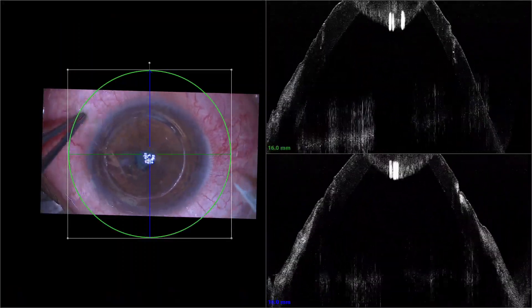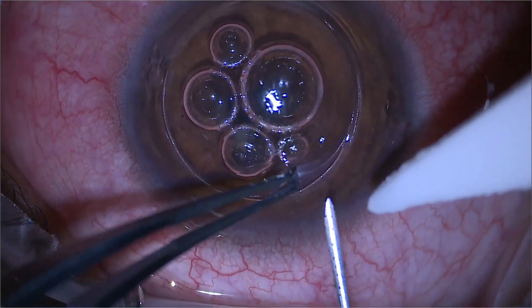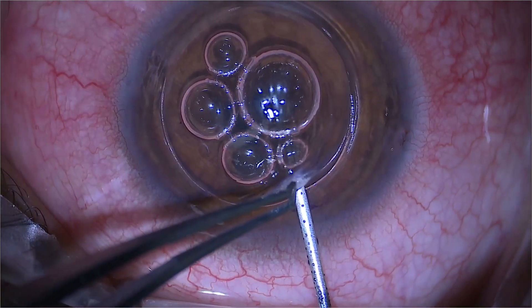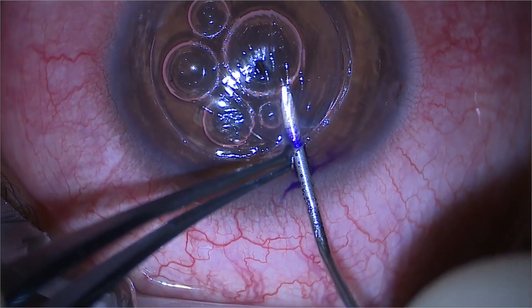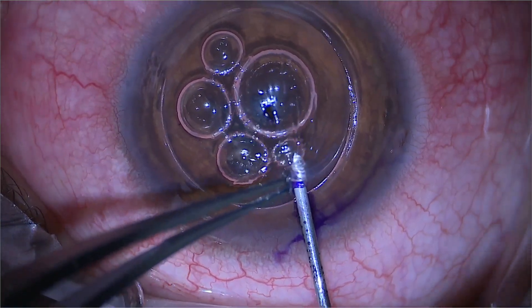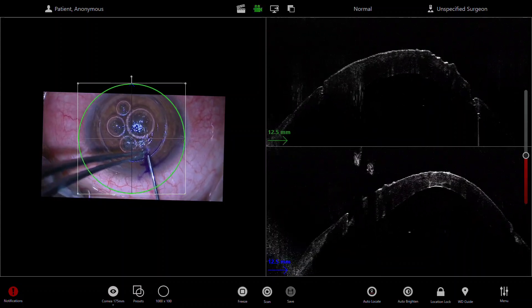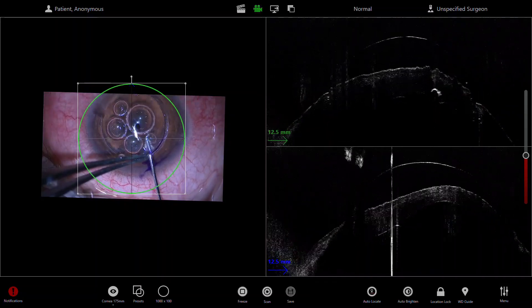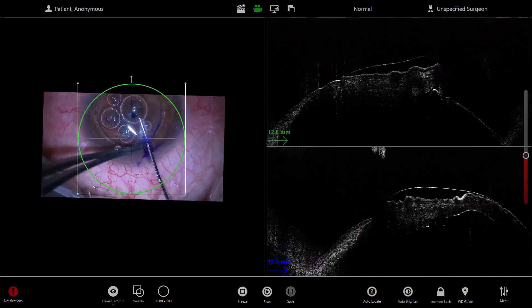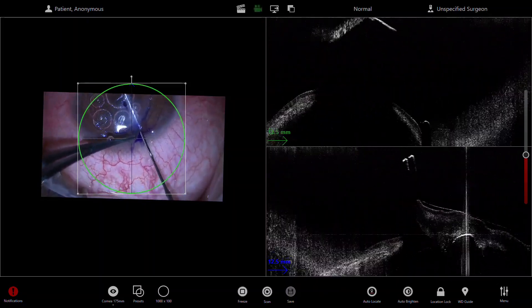The OCT is a useful guide to see how deep the trepanation is — you can see the marks quite clearly here. Now I'm using an orange needle that's been bent backwards, beveled down with a little bit of ink, to guide the cannula for the big bubble. Again I'm using the OCT microscope to help determine where the big bubble has been achieved, and you can see it very nicely here, so I'm guiding the cannula with the air just beyond the centre mark.